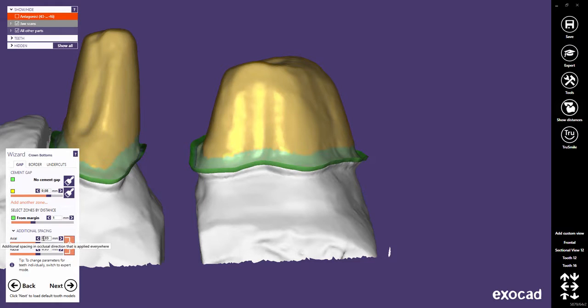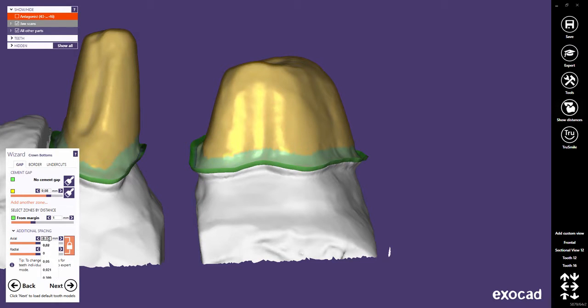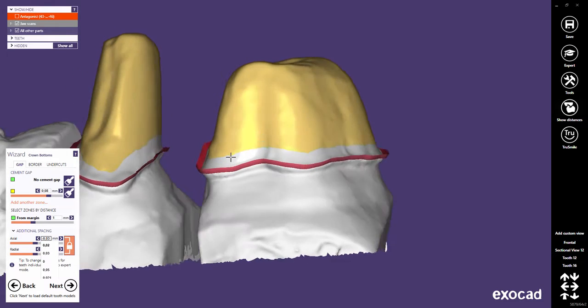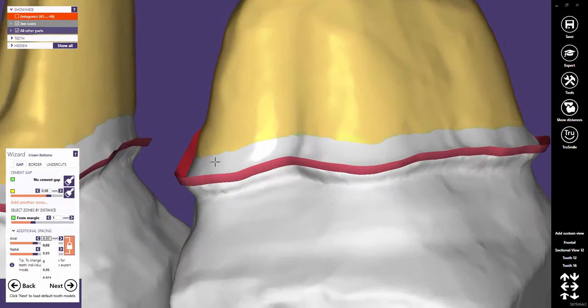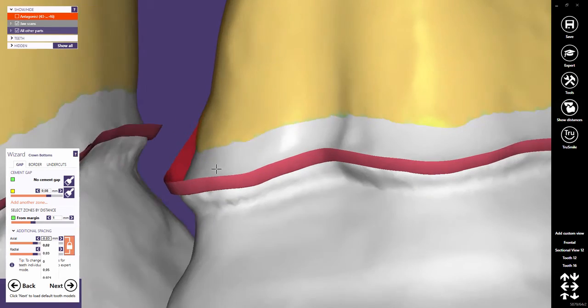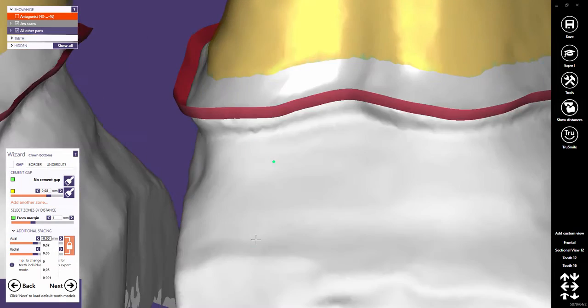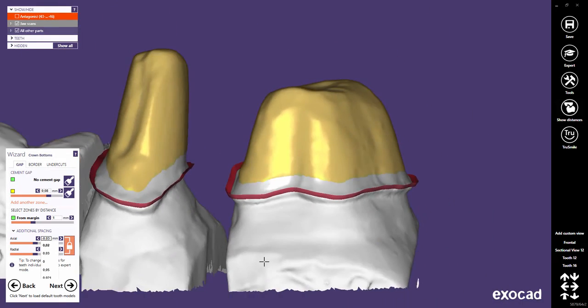You can also use negative values to create a tighter fitting. The result would be a crown that has a smaller bottom than the die. Note that negative settings may lead to manual work on the restoration.